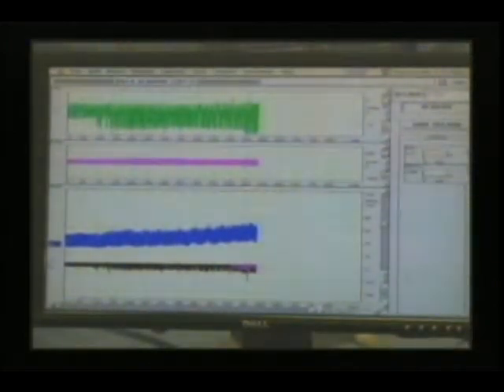With each inspiration, the ITP, or intrathoracic pressure, is decreased to -7.5 millimeters of mercury. Peak carotid blood flow is approximately 250 ml per minute, and the systolic blood pressure is approximately 70, with a diastolic blood pressure of approximately 45 millimeters of mercury.